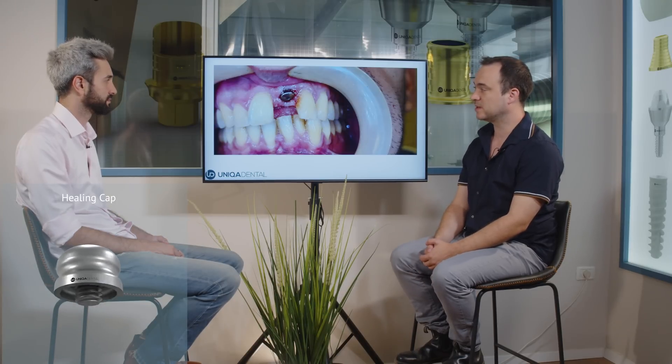This is the case where the patient went through a couple of gingival surgeries to add a little bit of gingiva in the buccal part. You can see the healing cap that's quite embedded in the gingiva. Later on, we took out the healing cap.